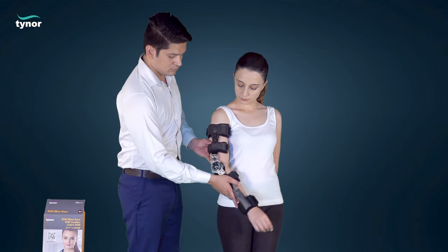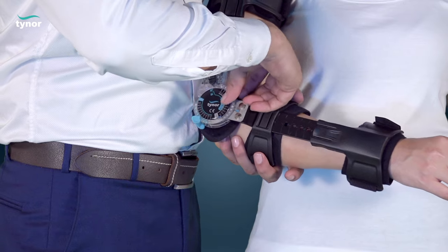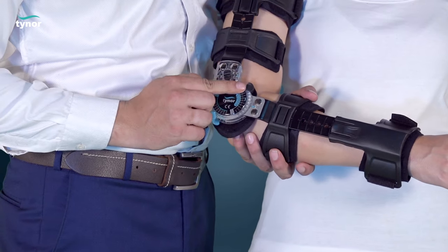Check the arm movement. Set the required flexion and extension angle.